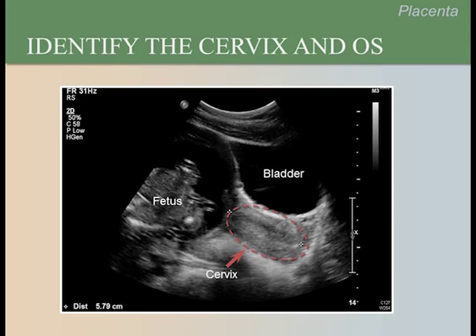Now we will remove the cervical outline to show the location of the internal cervical os. The calipers in the image are positioned at the internal and external cervical os. The cervical canal appears as a slightly darker line between the 2 calipers.